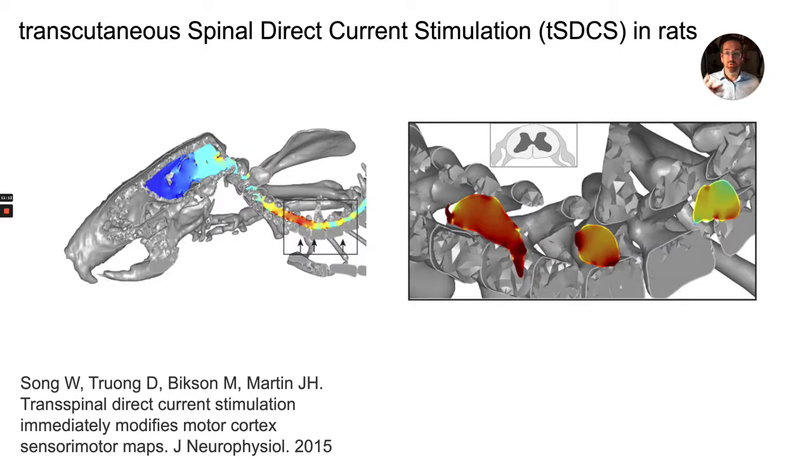The other thing we notice when we develop these very detailed models is what you're seeing here, where you're seeing these current concentrations that are, you can almost see little stripes of current concentration, and it's clear that the current is sort of being funneled between the bones. And so where you have these gaps, you have higher concentrations of current flow.